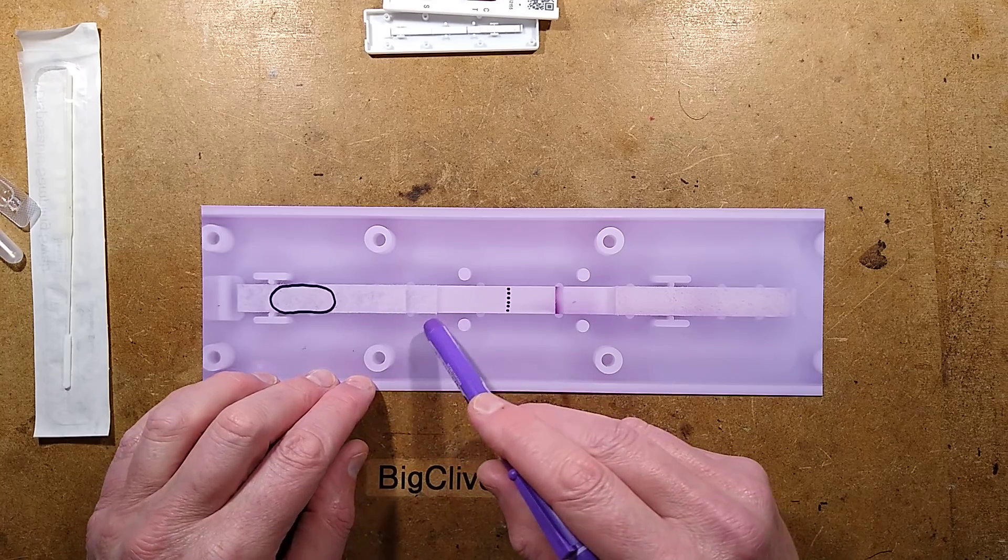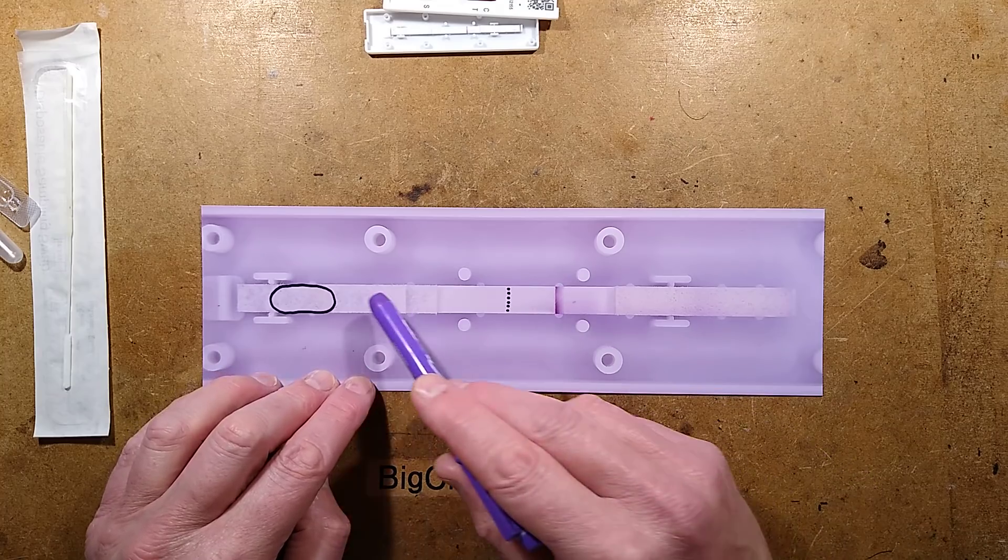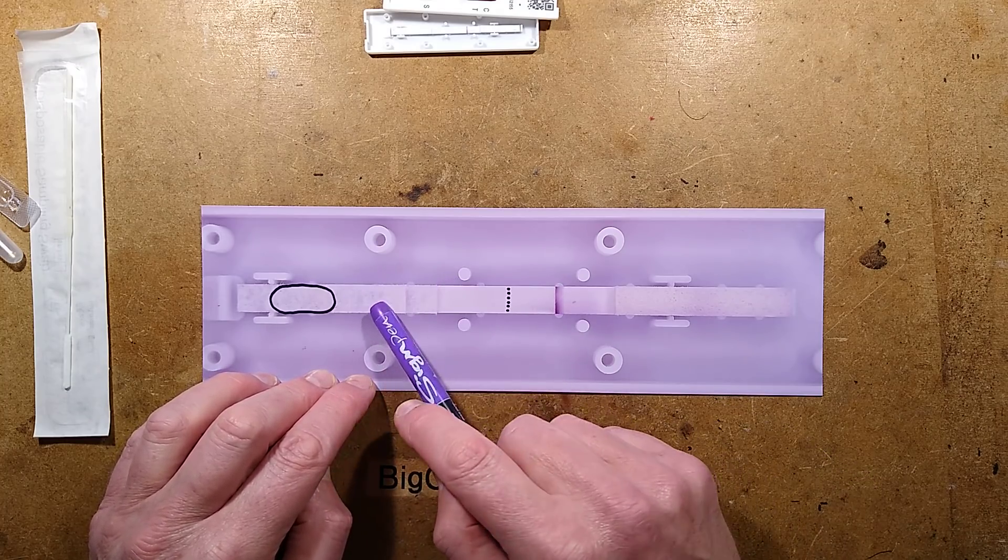But they've got other versions of these that can do multiple tests at once. So you can actually have a whole load of lines that as a liquid passes it will run a whole load of tests.